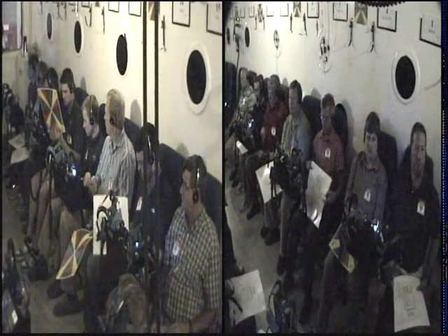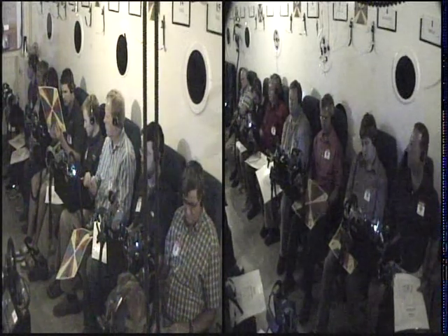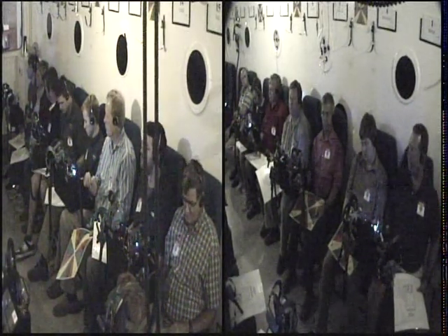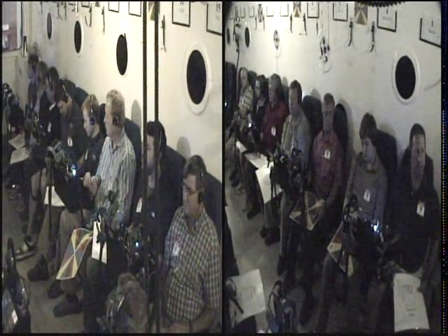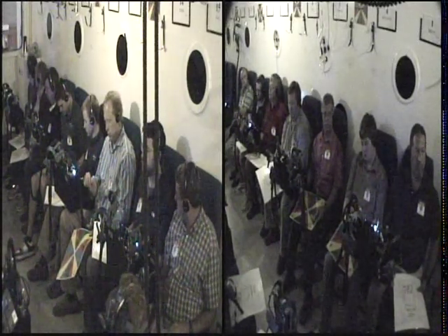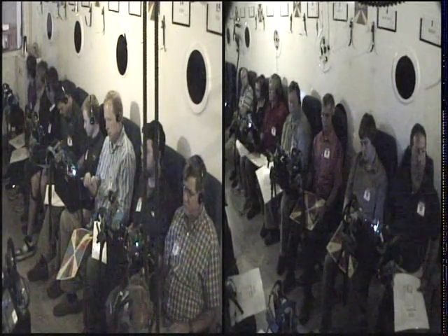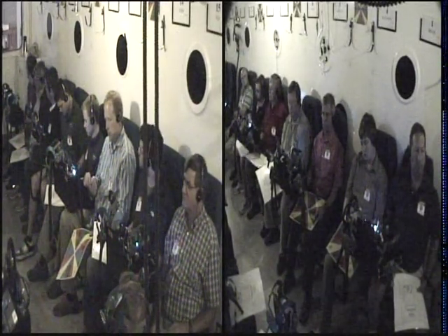Just to prepare you for what we'll do in about a minute and a half, I'll have you grab the card in one hand and your mask in your free hand, and I'll tell you to don it. Now, when you don that mask, go ahead and don it, but hold your breath until you are focused on the card. So if you have to set the card down to get that mask on, that's fine.